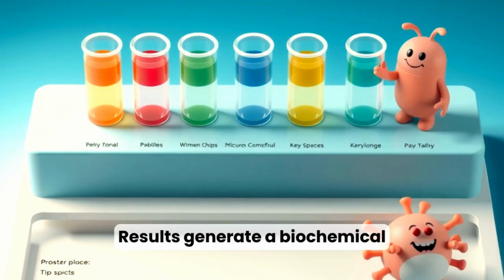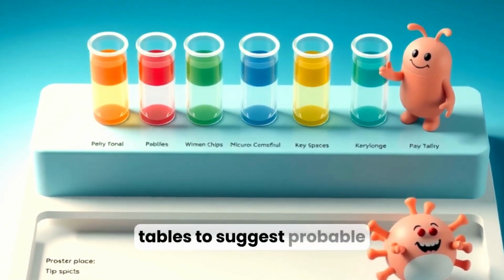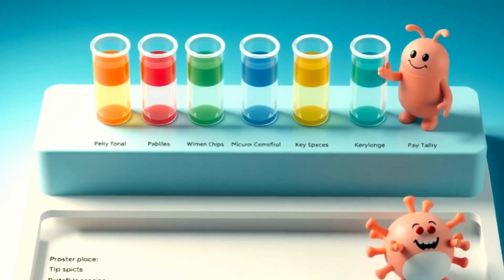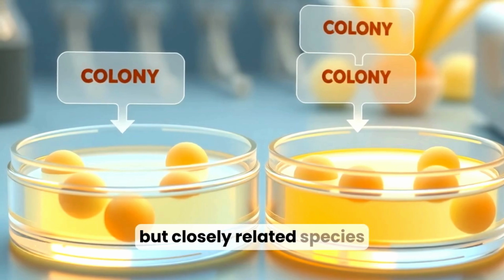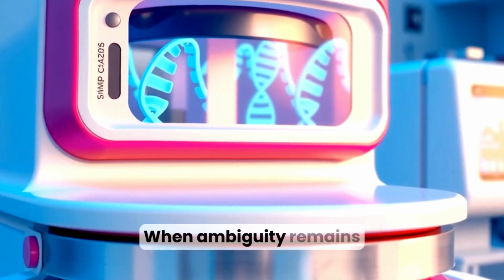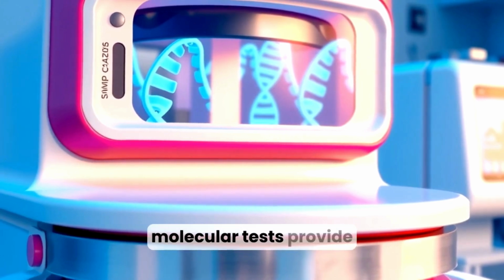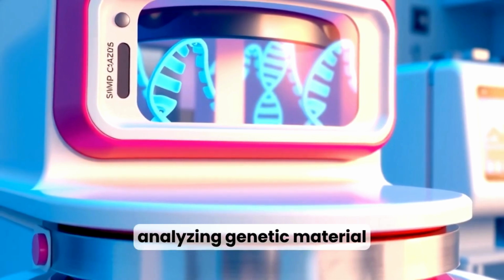Results generate a biochemical profile. Technicians compare that profile to reference tables to suggest probable identities. Phenotypic methods are powerful and cost-effective, but closely related species can share traits and require further testing. When ambiguity remains, molecular tests provide definitive identification by analyzing genetic material.